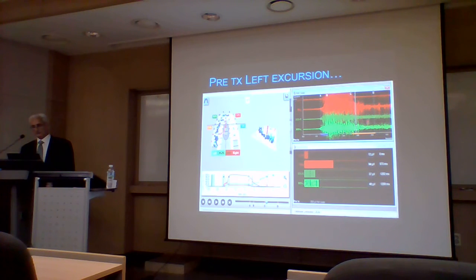And notice that the right temporalis doesn't fire at all, except for some spasm late in the movement.